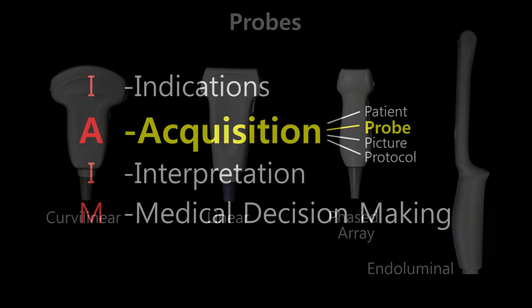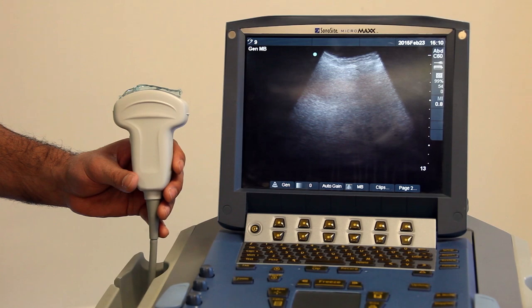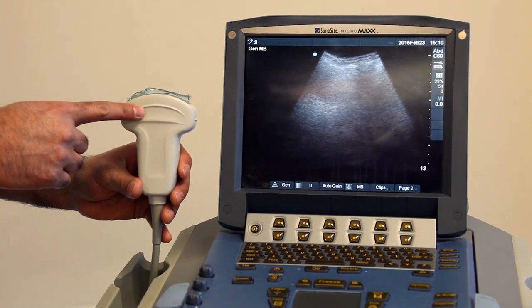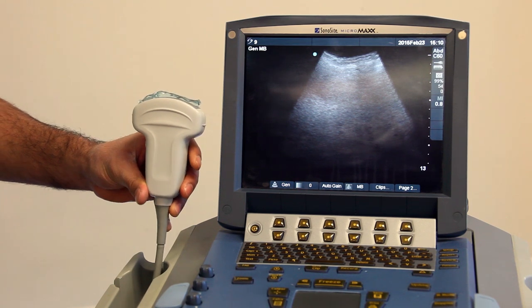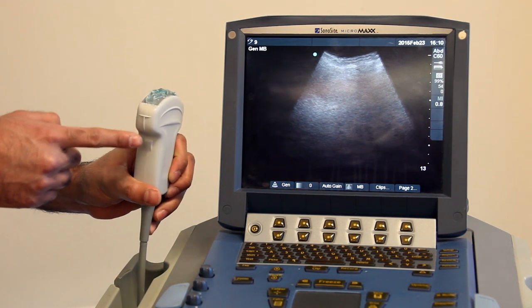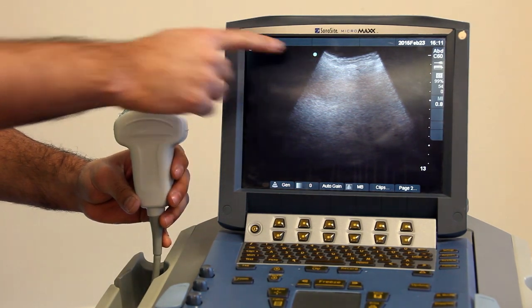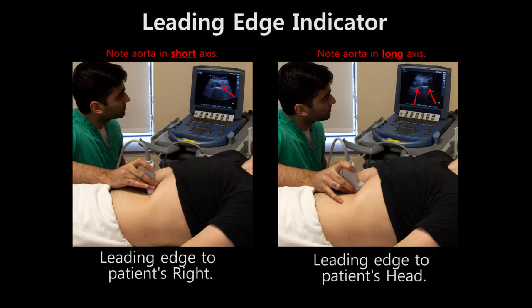Different probes can be used depending on what is being imaged. The most common probes are curvilinear, linear, phased array, and endoluminal. Each probe has a handle, a probe head containing the piezoelectric crystals, and a transducer surface. There is always a marker on one side of the probe designating the leading edge, which corresponds to a marker on the image to allow for correct interpretation. This marker on the probe is traditionally placed to the patient's right or to the patient's head.